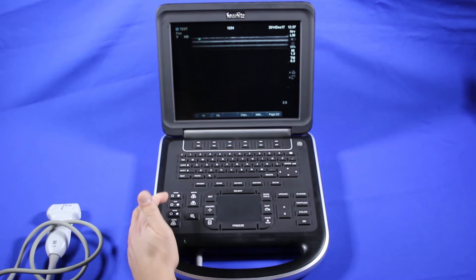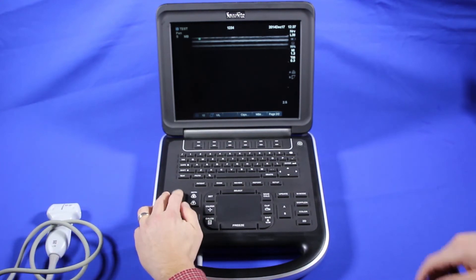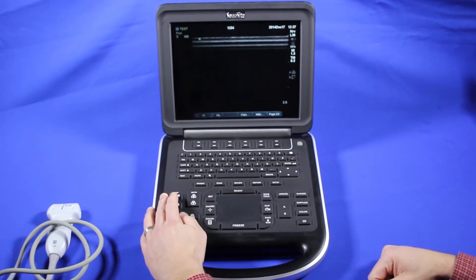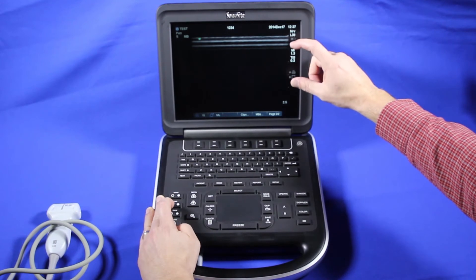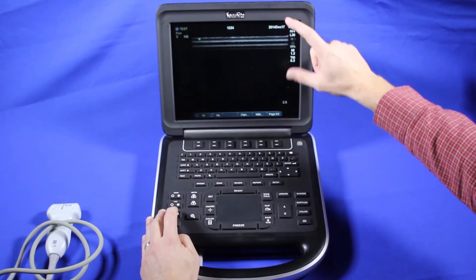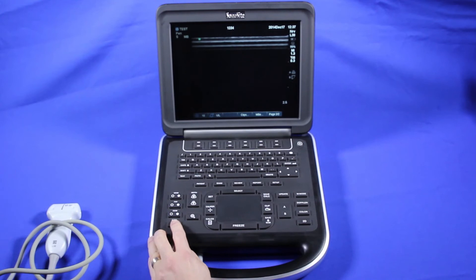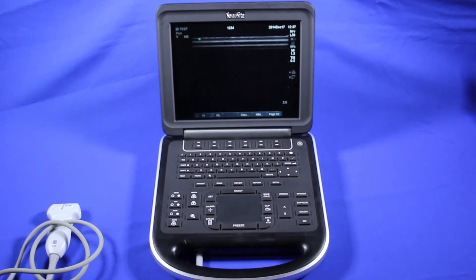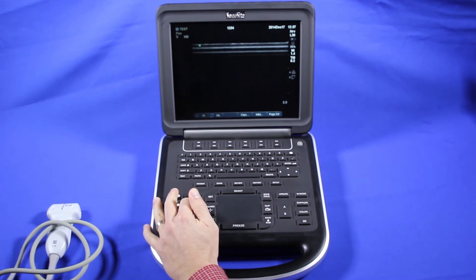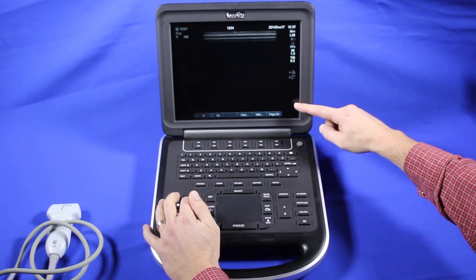For image optimization, we can use near — this will select the gain in the near field. Far field will take the far field, and gain will take the overall image. Many just prefer to hit auto, which will try and optimize the gain throughout the image for you. Here, we can adjust the depth of the image, and you'll see that the depth change is shown at the bottom.